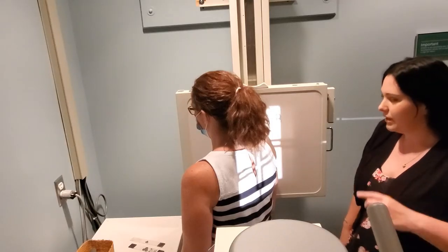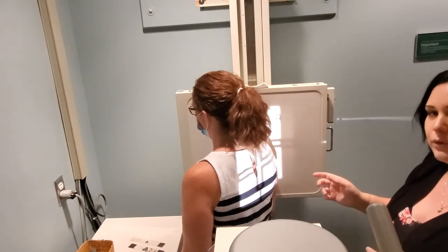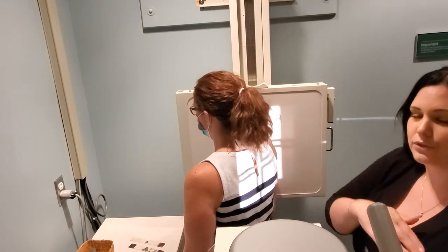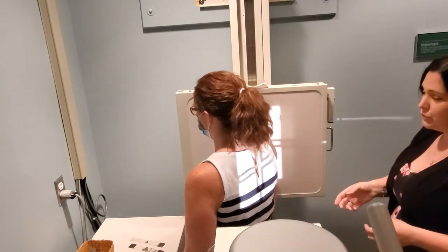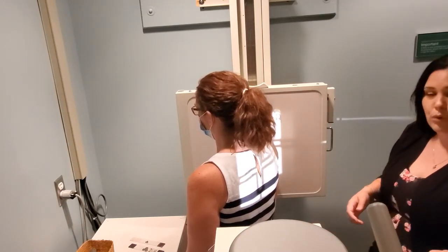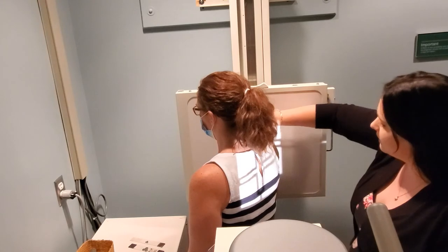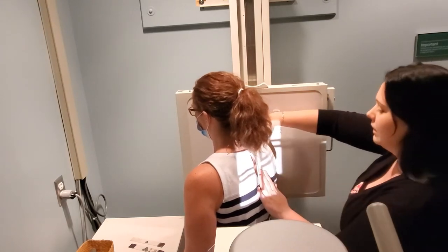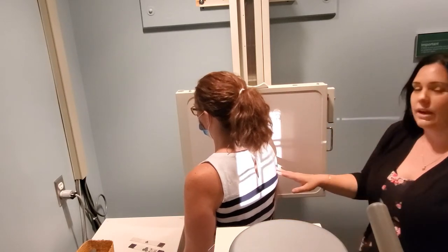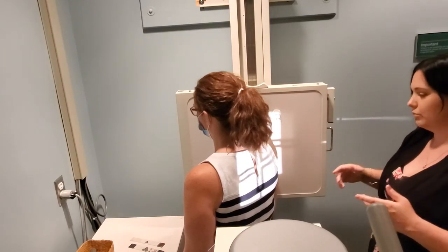From the PA oblique scap Y projection, you can also do the lateral scapula projections. Turn to your lateral scapula section in your packet. These projections are performed almost identically to the scap Y — the only difference is hand placement. You still cup the humeral head to get it centered, and still use your finger to confirm alignment. Depending on which area of the scapula you're looking at, the hand goes in two different positions.